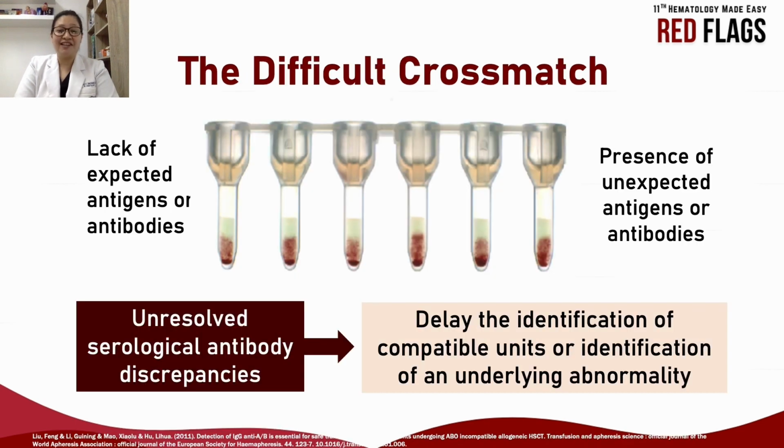We have already discussed pre-transfusion testing. Now let us review the basic approach to a patient with difficult cross-matching. In our practice, we may encounter concerns regarding difficult cross-matching. These discrepancies in serological testing may occur for a variety of reasons.